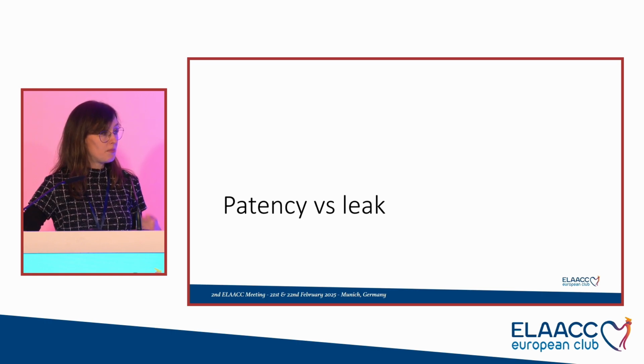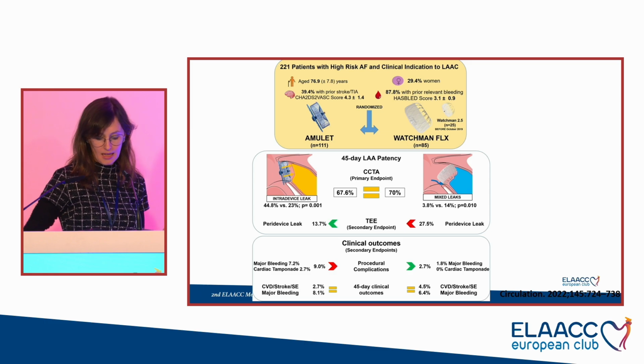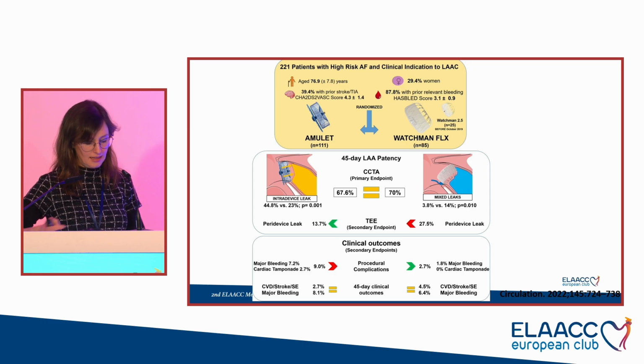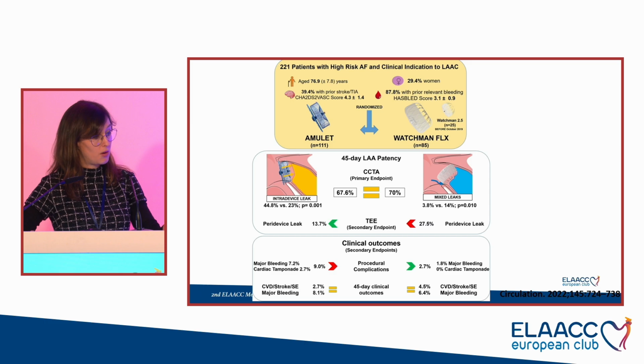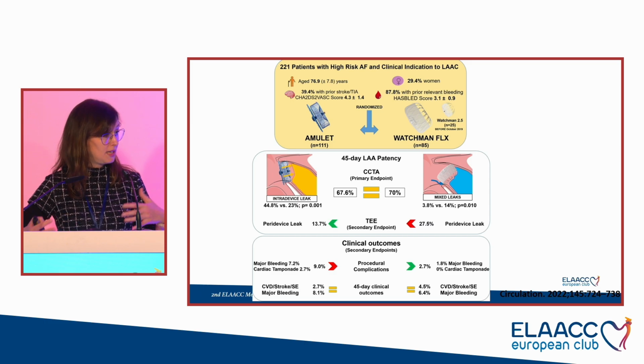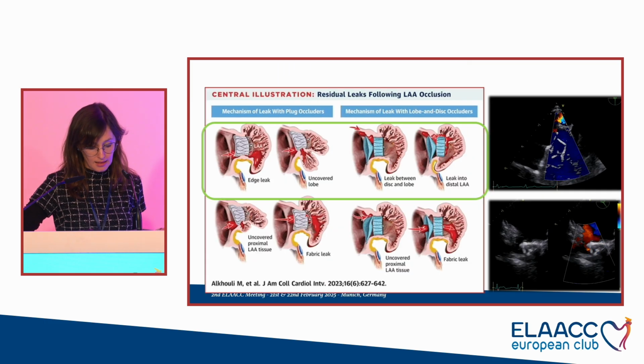And with CT, mainly, all the studies were focused on patency, and it's not the same to have patency as to have leak. For example, this very famous study, the Swiss Apero, the one we saw just in the middle, comparing one device with the other: when we evaluate with CT there were no differences, but when we look with TOE, the difference was almost double. So we need to agree on what we are looking for and how we are looking for it in future studies, I think.